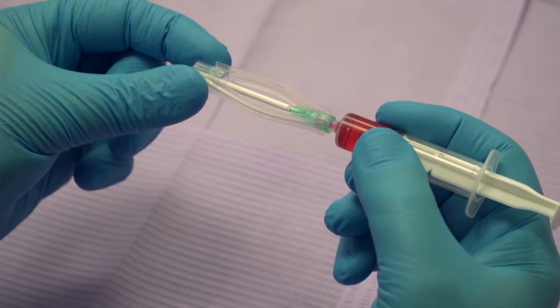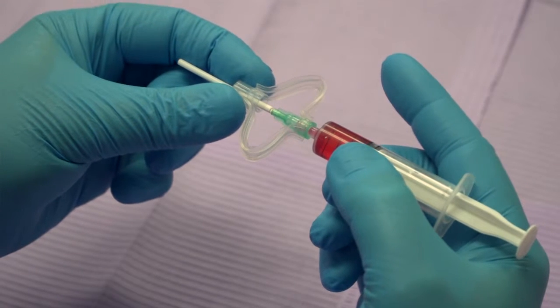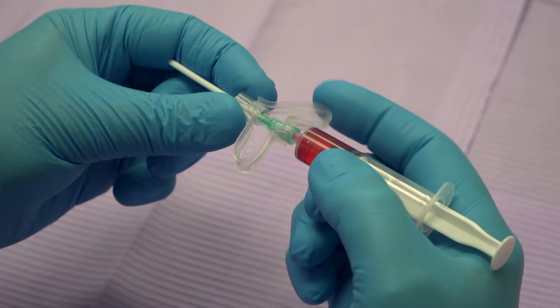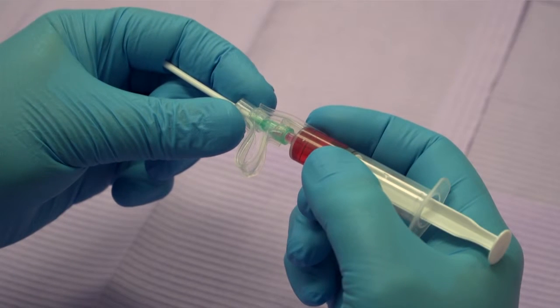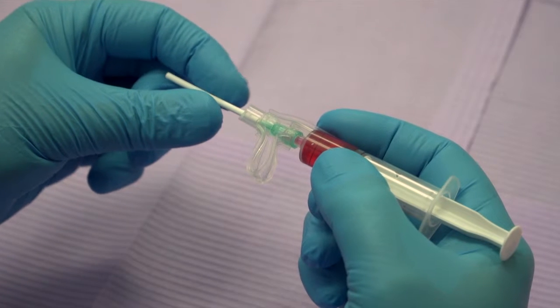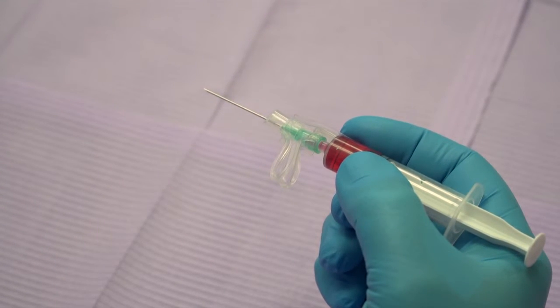Hold the syringe in normal position for the procedure, and then make the Reflex Safe Needle ready for use by holding the syringe near the bottom of the syringe barrel while pushing the protective end cap towards the syringe. The silicone sleeve will fold into the shape of two wings. Remove the protective needle guide straw while holding your grip on the silicone sleeve's wing.